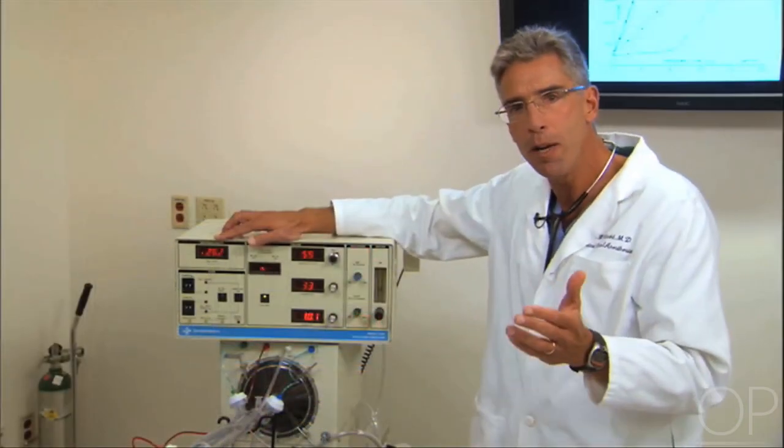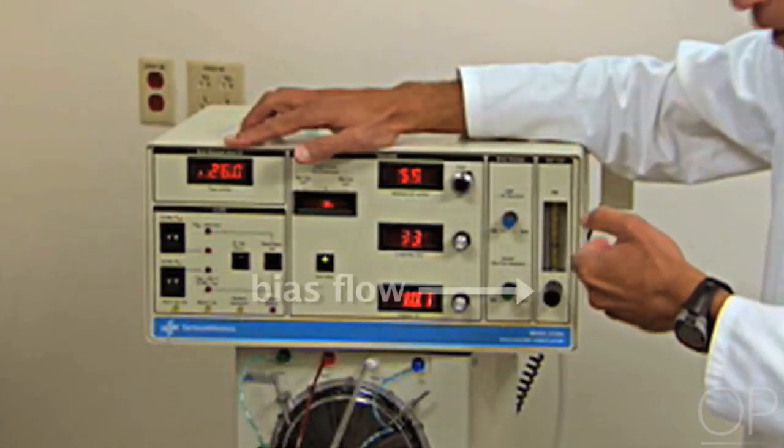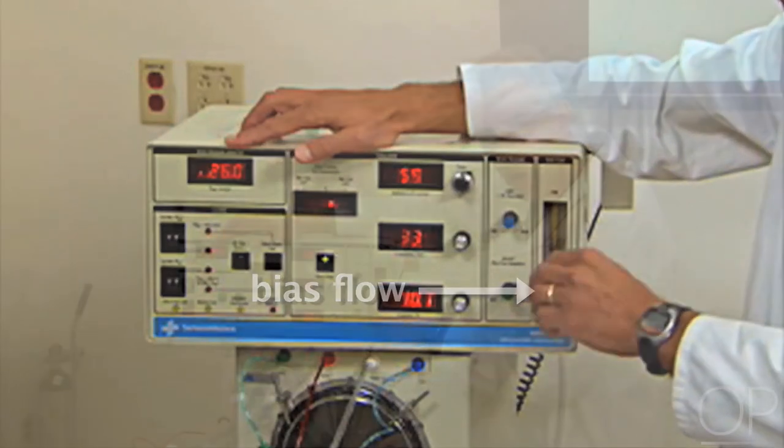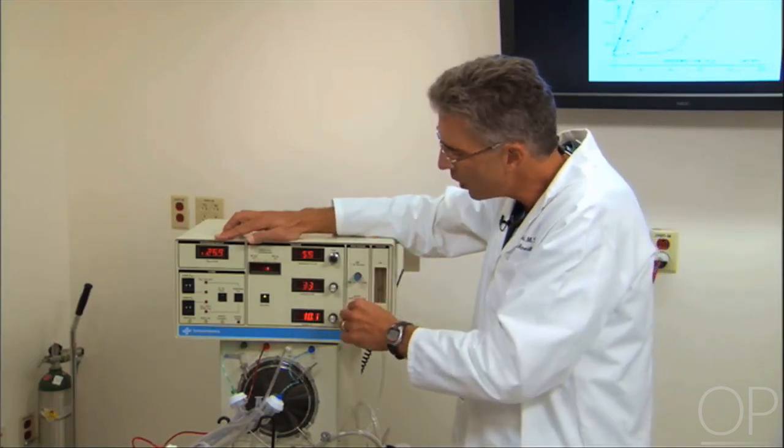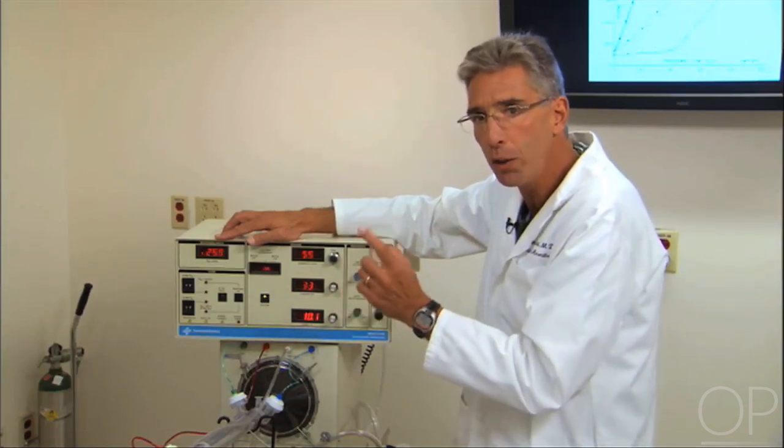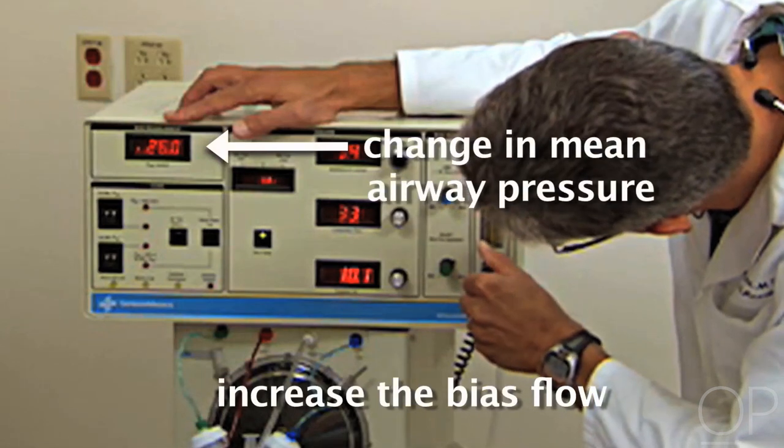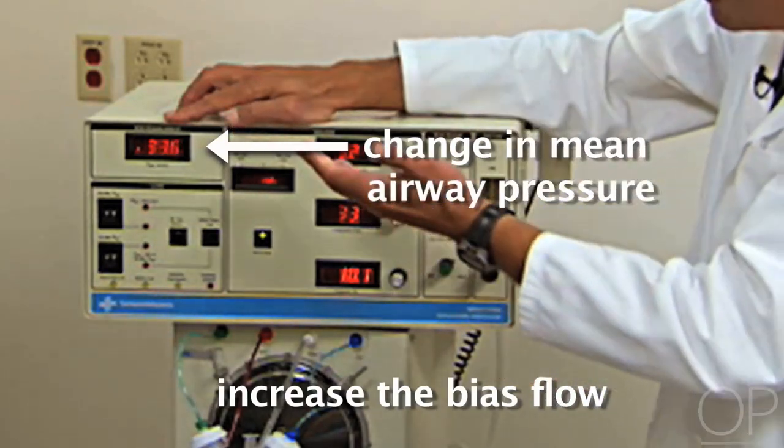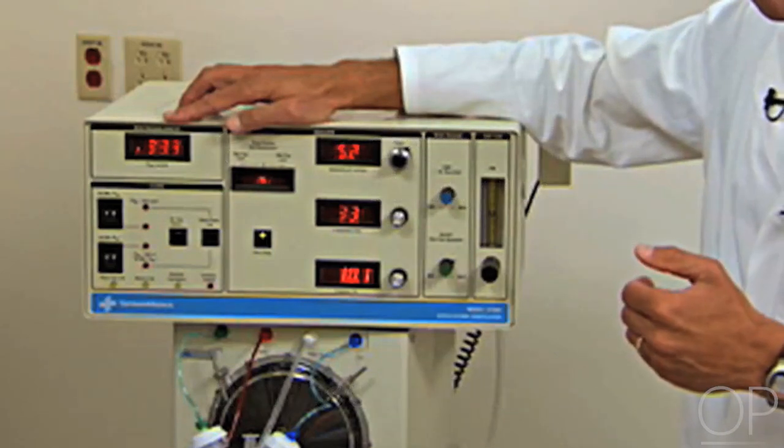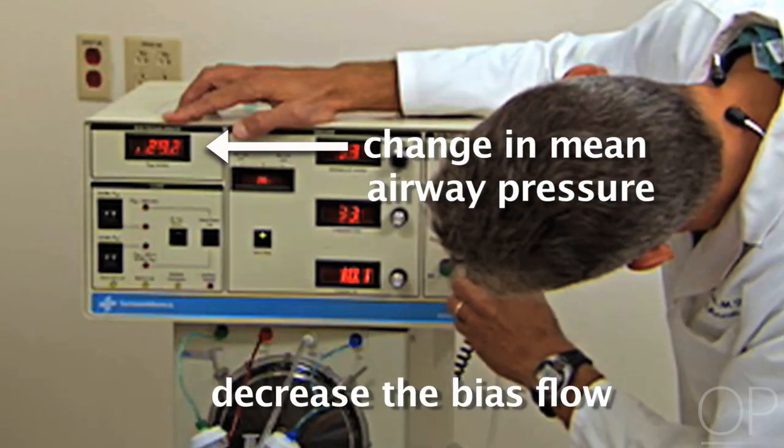And the other way to manipulate mean airway pressure is to increase the flow through the circuit, through that fixed orifice, and that's called the bias flow. And we can do that by manipulating this knob. All patients need to start with a bias flow of 20 liters per minute. Occasionally, when you've increased mean airway pressure maximally by closing the orifice, you will need to increase the bias flow to further increase the mean. So I'm going to now increase the bias flow from 20 to 25 to 30 liters per minute. And look what it's done to the mean airway pressure. It's increased it dramatically. Let me go back to 20 and you'll see that in reverse. 25 and 20. So that's mean airway pressure.